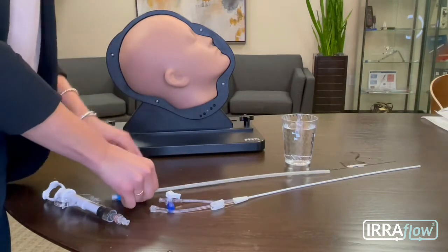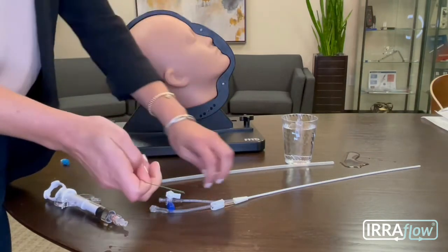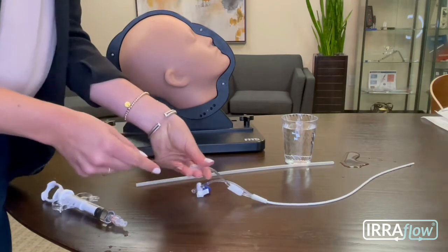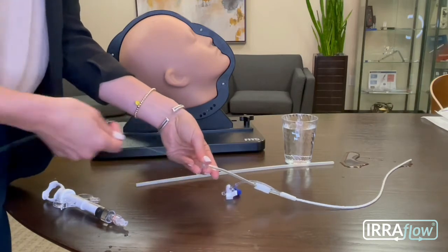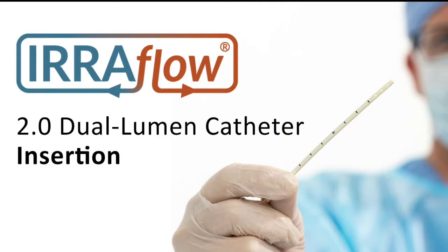Once you've flushed the catheter, we then need to insert the soft stylet. The soft stylet will go into the drainage lumen. You'll want to unclamp the lumen and advance the soft stylet, ensuring it advances smoothly. Now the catheter is fully prepped and you're ready to insert.